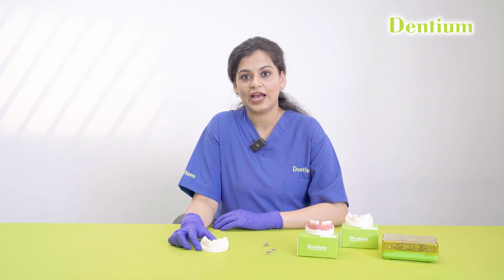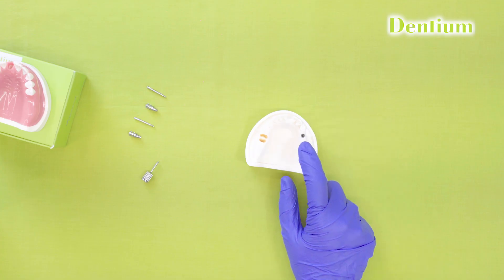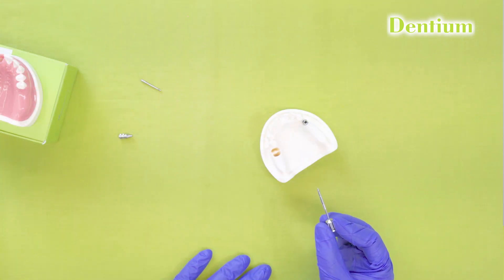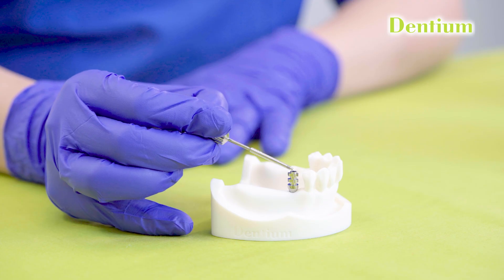Let's start the process of taking an impression on this dummy model. I have already placed an implant in the 4-5 region of 4 mm diameter and 10 mm length. I will be placing a hex impression coping of 5.5 mm diameter and short length for this case.